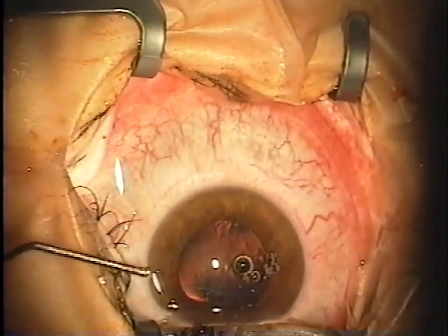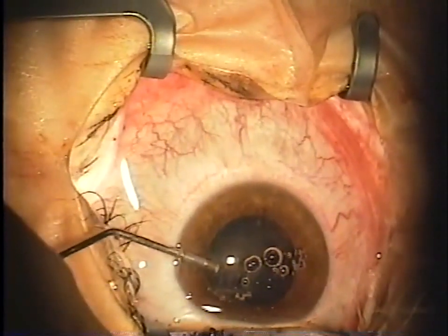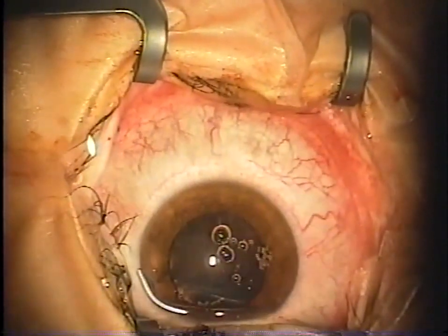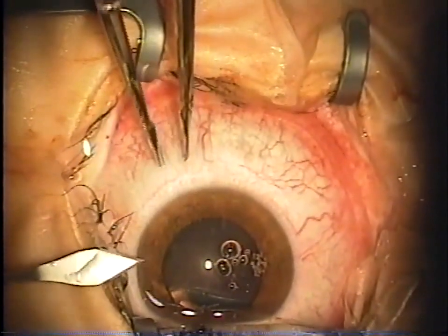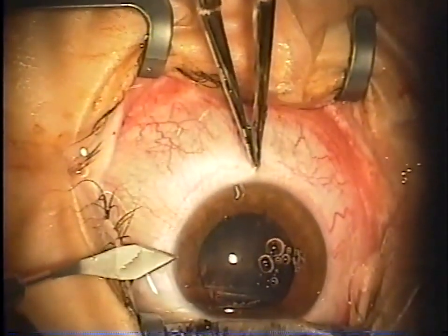So here you'll see me instill a little bit more OcuCoat. You want to be real careful with these eyes since they are phakic to not touch the lens at all. As a result, deepen the chamber a little here, and you're going to see me drag my wound just a little bit to increase it to a 3.5 millimeter range.